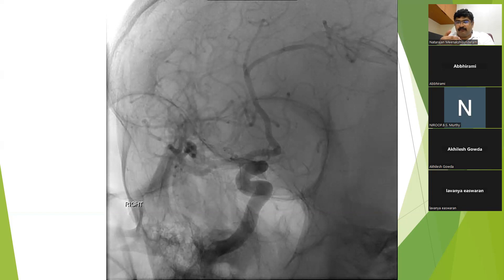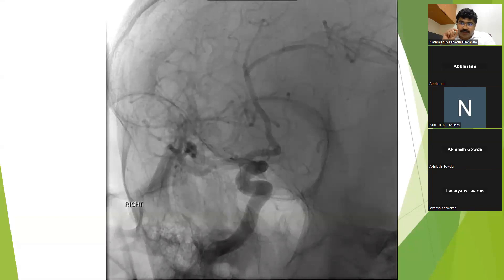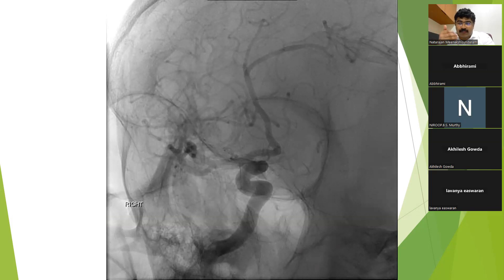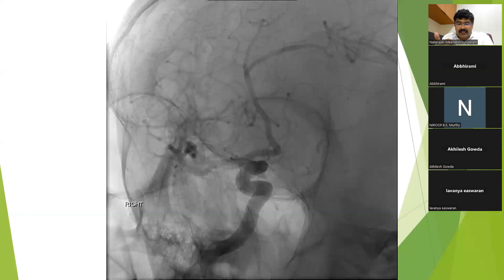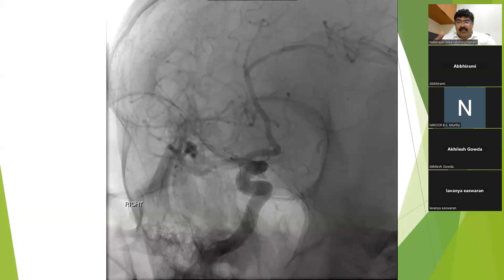We will again discuss ICA aneurysms when we take them up independently. I am only now demonstrating the DSA pictures to orient you to ICA anatomy and the various branches of the ICA. In subsequent sessions, we will study individual vessels, their angiographic findings, and surgical approaches. The goal now is to give an outline and help you understand how to read a DSA.